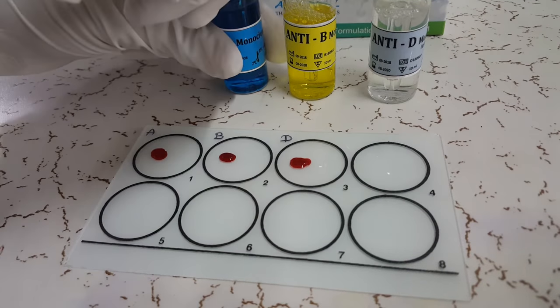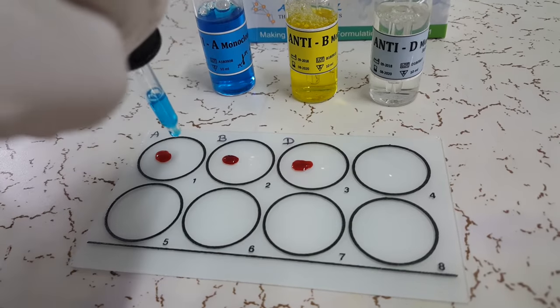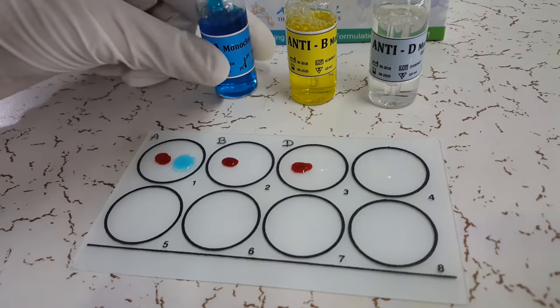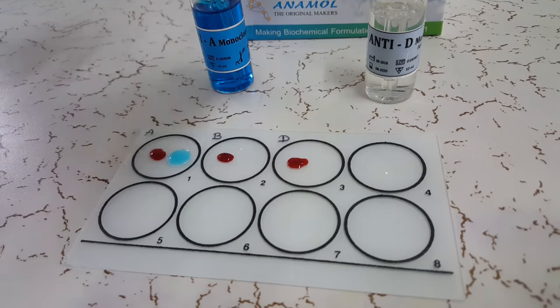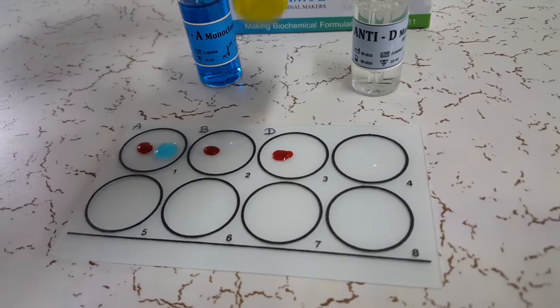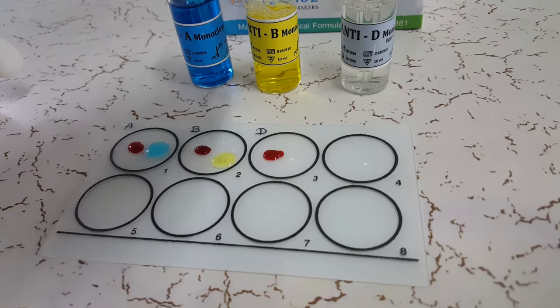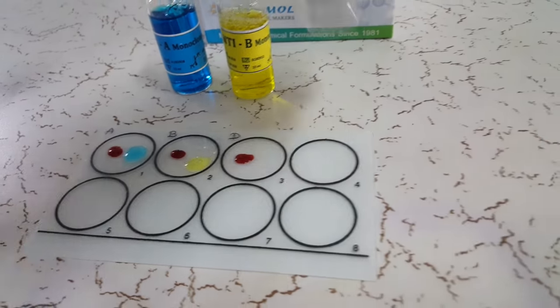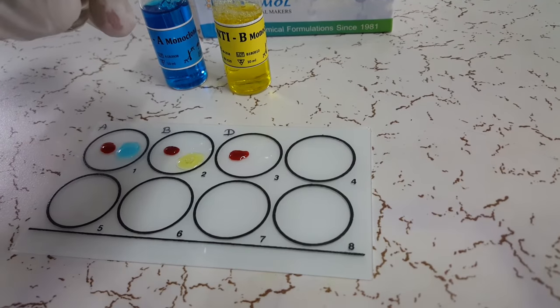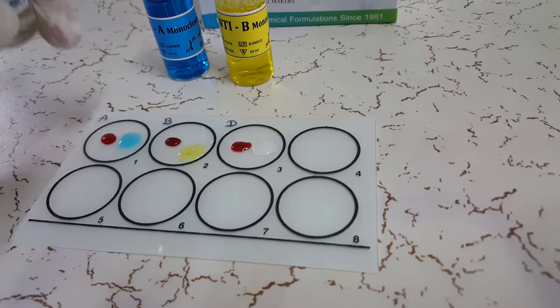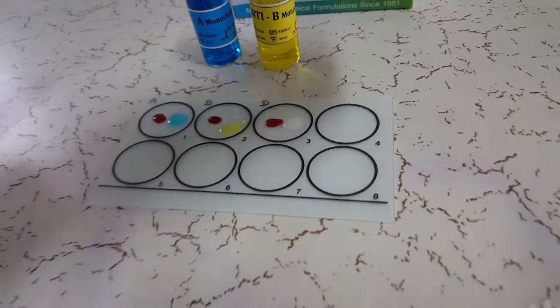Next, place one drop of monoclonal anti-A antibody on the first circle. Place one drop of monoclonal anti-B antibody on the second circle. Next, place one drop of monoclonal anti-D antibody on the third circle.